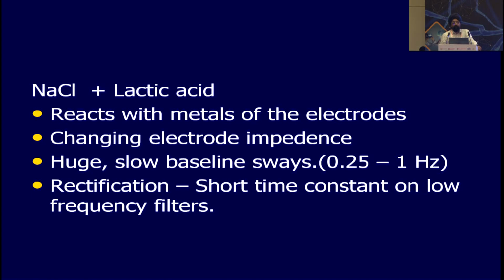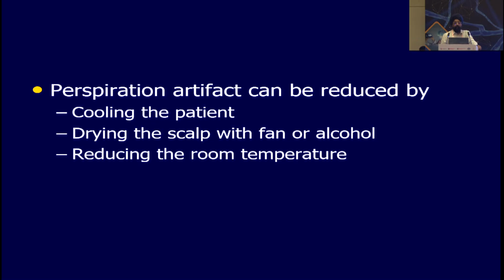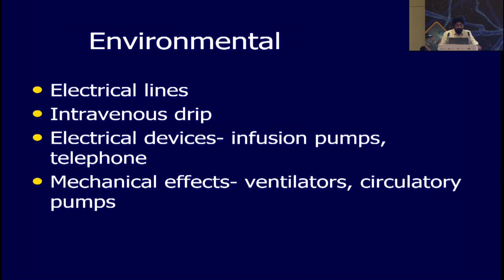So it is because of sodium chloride and lactic acid. It reacts with the metals of the electrodes, changes the electrode impedance, causes huge slow baseline sways from 0.25 to 1 Hertz. Rectification: short time constant on low frequency filter should be done, and you can cool the patient, switch on the AC when the EEG is going on, dry the scalp with fan or alcohol and reduce the room temperature.